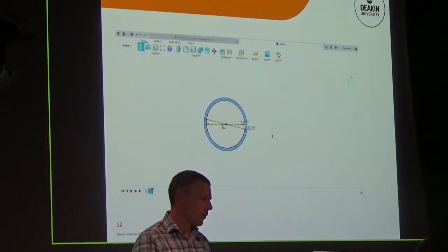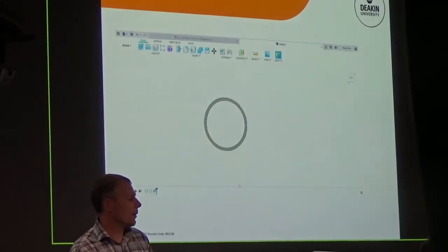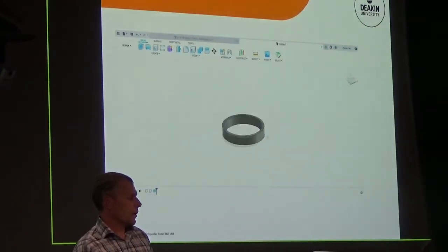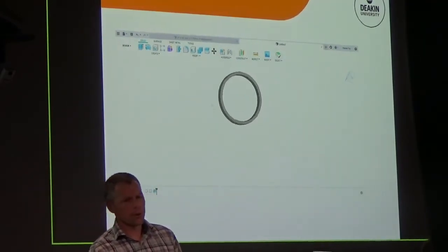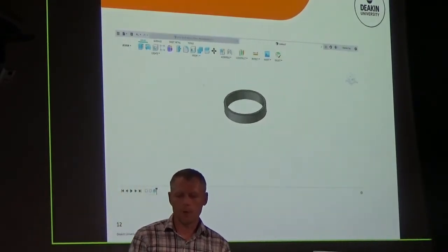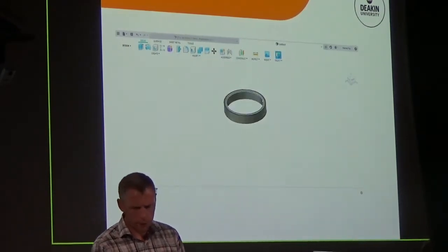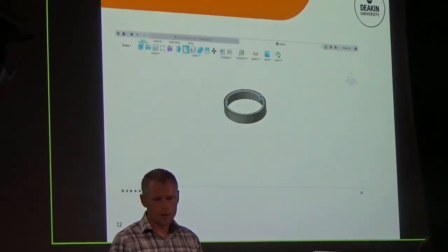And now I'm doing a little bit of a push method, or extruding the design, making it bigger. And in a second, when I get my mouse, it will spin around. And now we've got a ring. So now that is an object. Now I've got the exact size of an object, the distance from the centre to the outer circle. And then if you want to, you can start using some different tools to modify it, making the edges a little bit smoother.